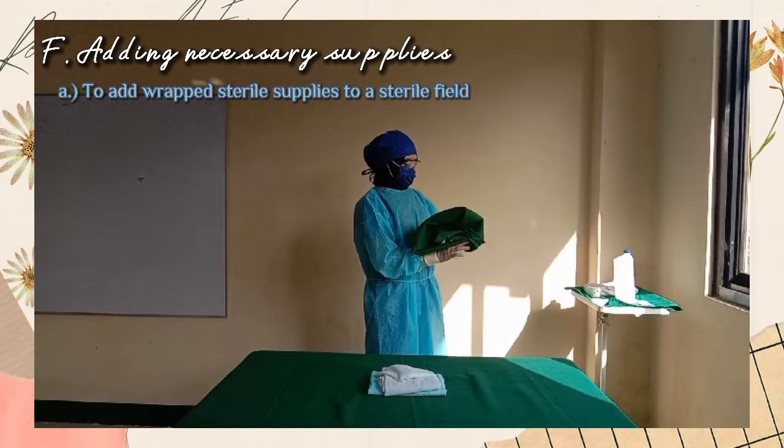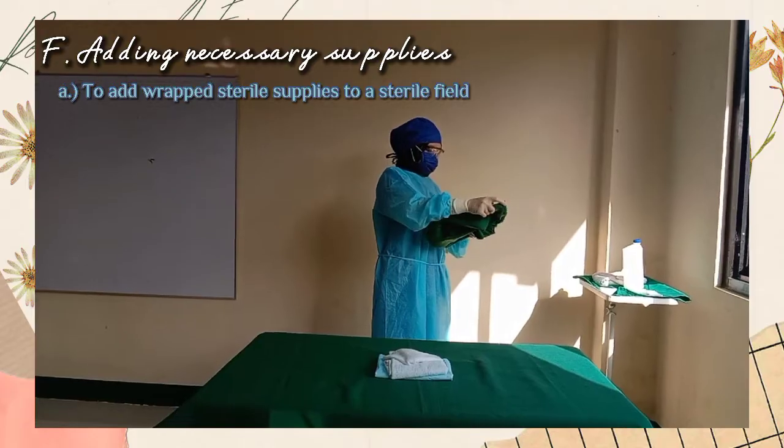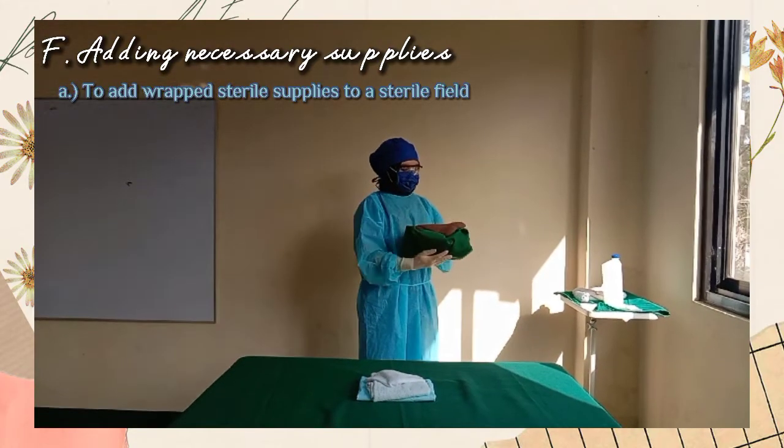This would expose the item inside the wrapper, taking care not to touch the surface of the wrapper or the item. Grasp all the corners of the wrapper together with the non-dominant hand and pull back towards the wrist, covering hand and wrist. Hold in place.